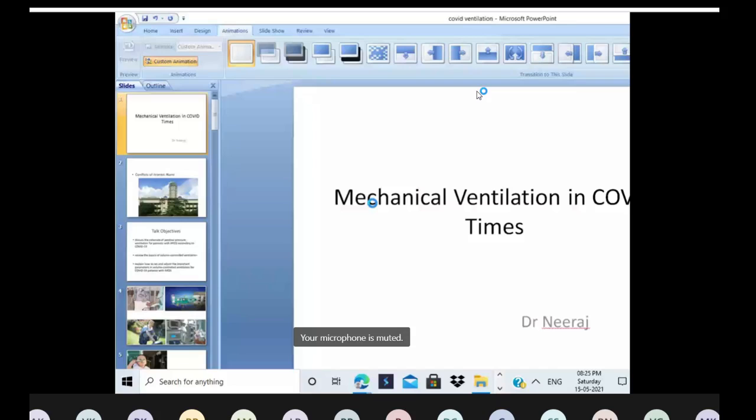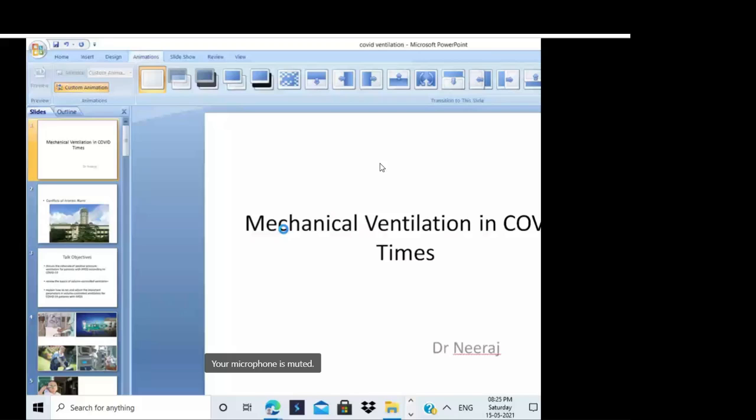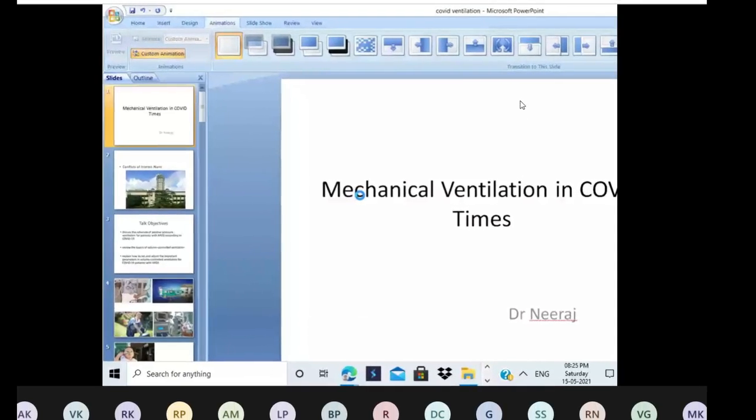So for the next half an hour or so, I'll be detailing the very basics of mechanical ventilation. As Vineeth rightly pointed out, mechanical ventilation is unphysiological, but at times of dire straits, like where non-invasive ventilation fails, and even switching from a conventional NIV ventilator to a mechanical ventilator based NIV still fails due to the severity of the illness, then we are at dire straits. At that time, we will be obliged to go for mechanical ventilation.